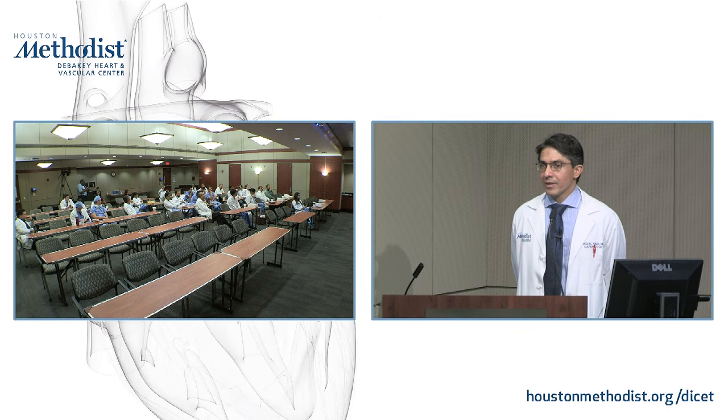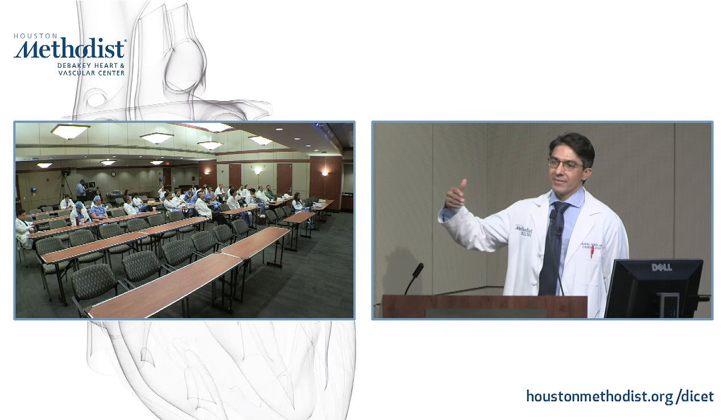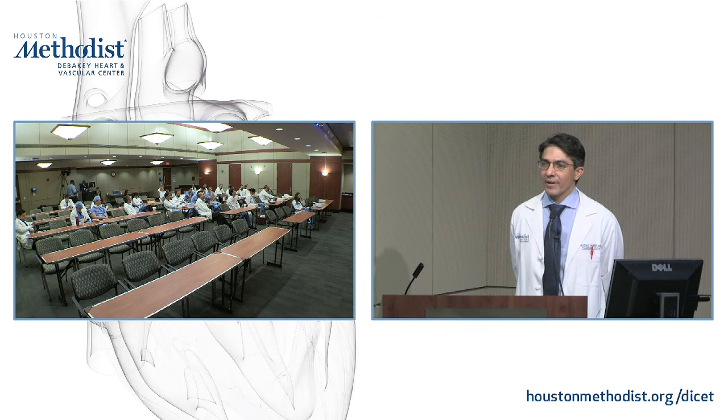Are you using flash when you do a calcium score also? No, we use the same protocol that is recommended for calcium scoring. So you're not gating for that? We're gating. Oh, you're gating. Okay. Gating, yeah.